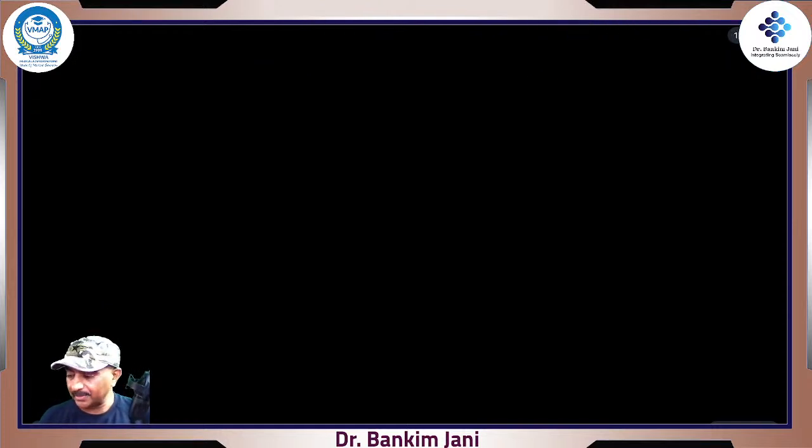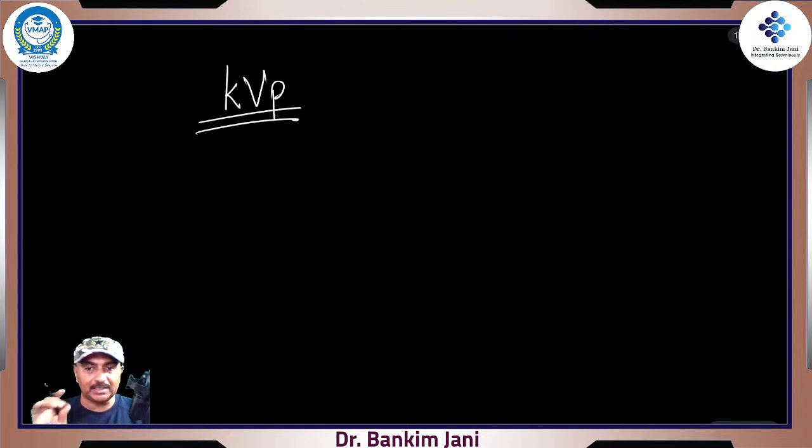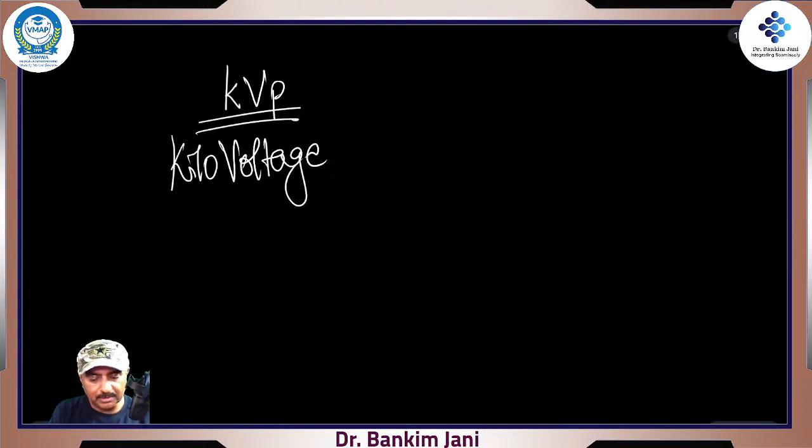Because we are dealing with X-rays, we'll be having only two factors, because now we'll be talking about X-ray chest. These factors will come into the picture. We'll be using two things. One is what is called the KVP. KVP is what? It is kilovoltage. Kilo means 1000. So now you know that when you take the X-rays, a big noise comes because there are transformers which pump the voltage into thousands of volts. So this is kilovoltage peak.